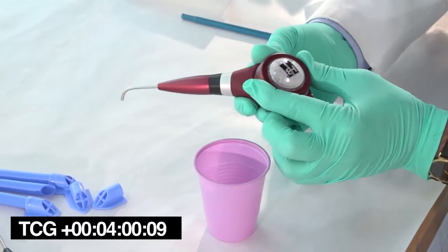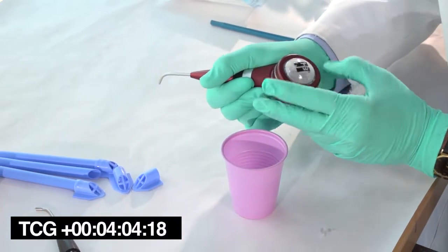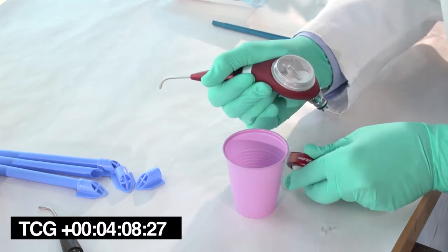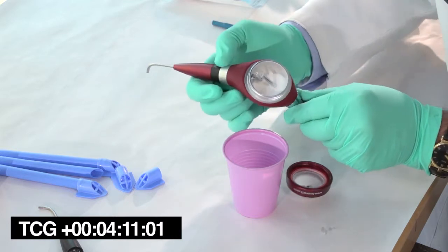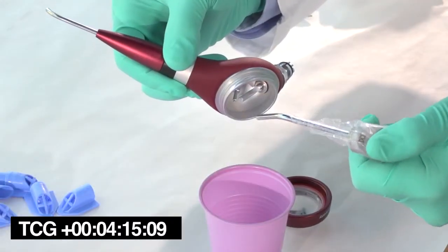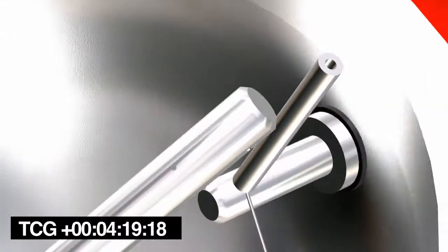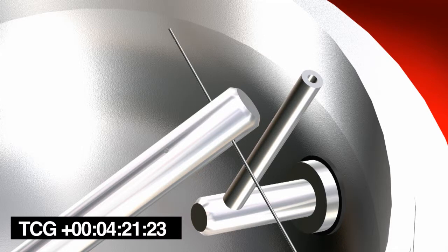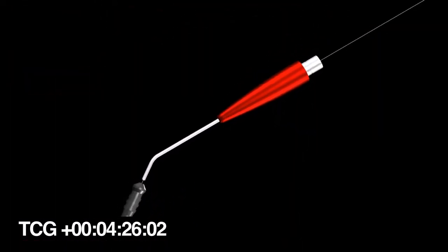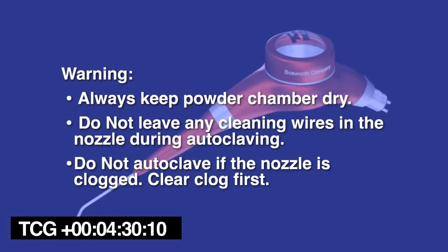Clean the air polisher after each use in order to assure that all of the air and water ports are clean and dry, as well as clog-free. Empty the reservoir of any remaining powder and discard. Blow out the chamber with air. Insert the appropriate size cleaning wire in each air and water port, making certain they're clear. Thread the wire or orthodontic wire into the nozzle. Always keep the powder chamber dry.